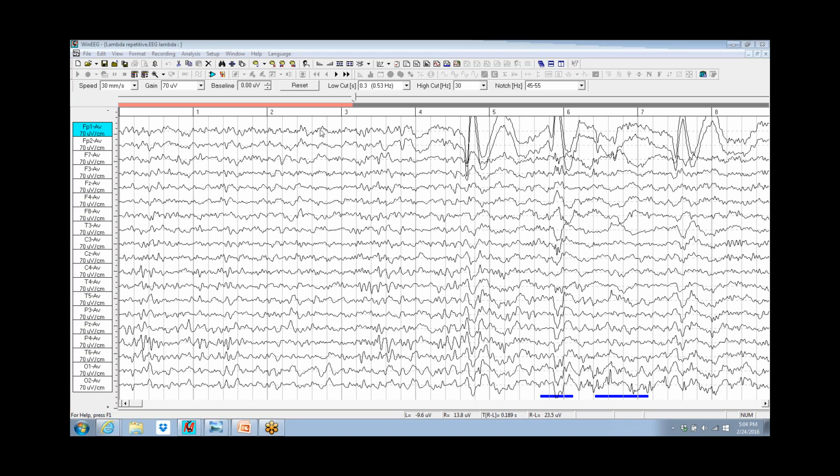The oscillations are basically alternating current signals, AC signals, because they go up and down across time. And the AC EEG is assumed to be an ongoing rhythm of the brain. And it's full of little episodes where the brain is responding to stimuli from outside.